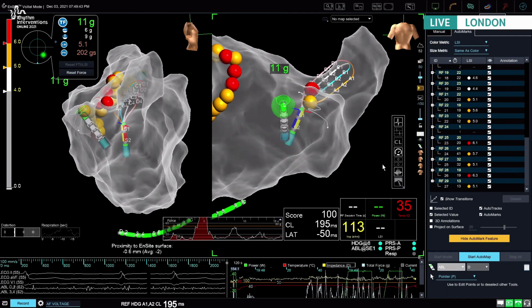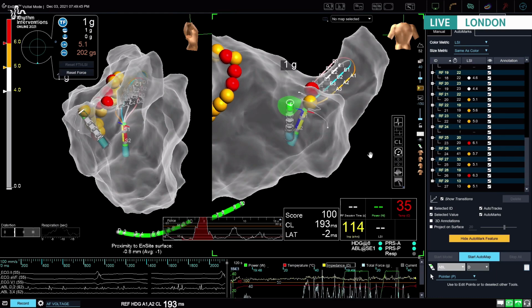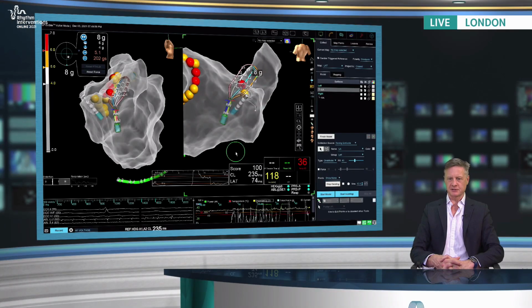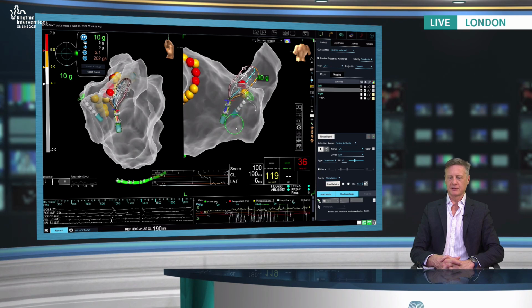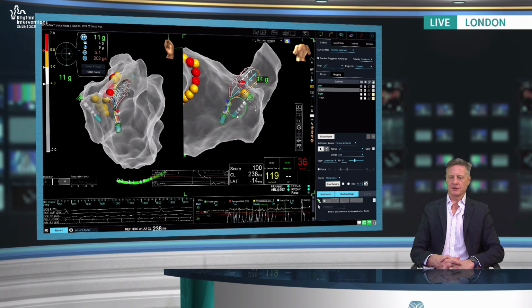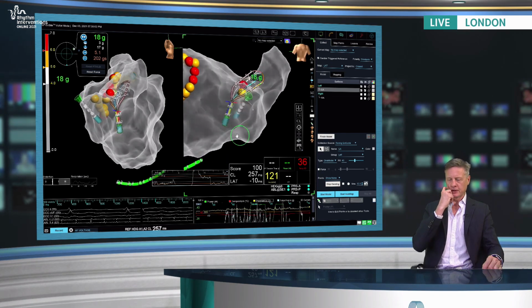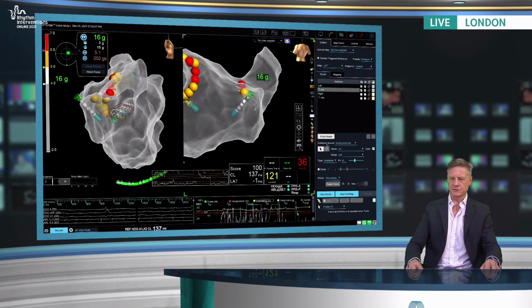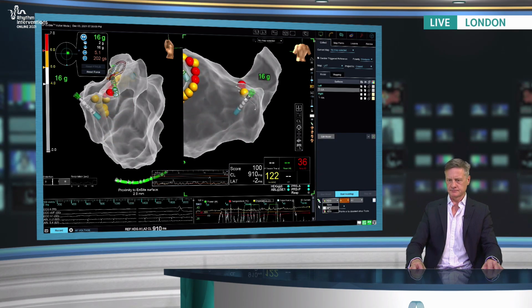Scrape out one. There you go. Yeah, no, so I think we saw the pre-ablation signals from the grid, but we didn't see the post-isolation. Can they show us those? And maybe while they're coming up, Hugh, what do you think about unipolar, bipolar, and directionality? Is that still a significant issue for us in electrophysiology?